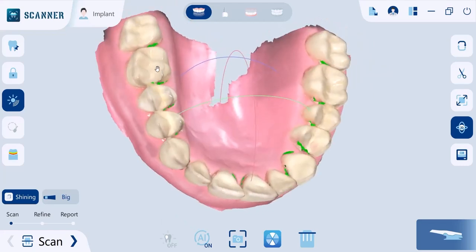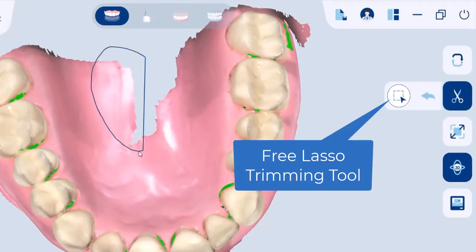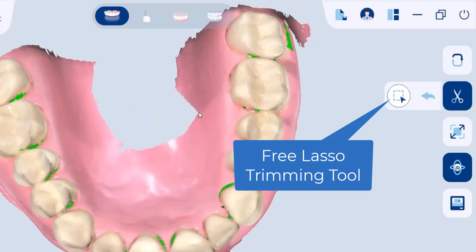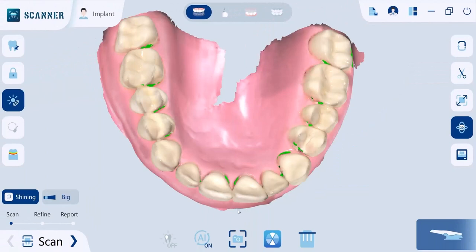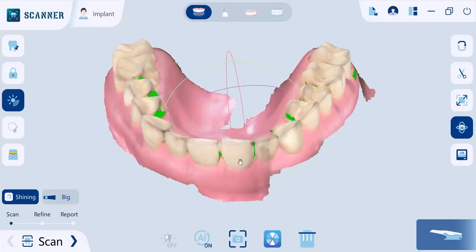After scanning, here are some features you will surely need to enhance your model. Use the free lasso trimming tool to remove unnecessary data. According to your needs, you can switch between monochrome and the patient's hard and soft tissue actual color. You can also use the vivid display mode for better visibility.